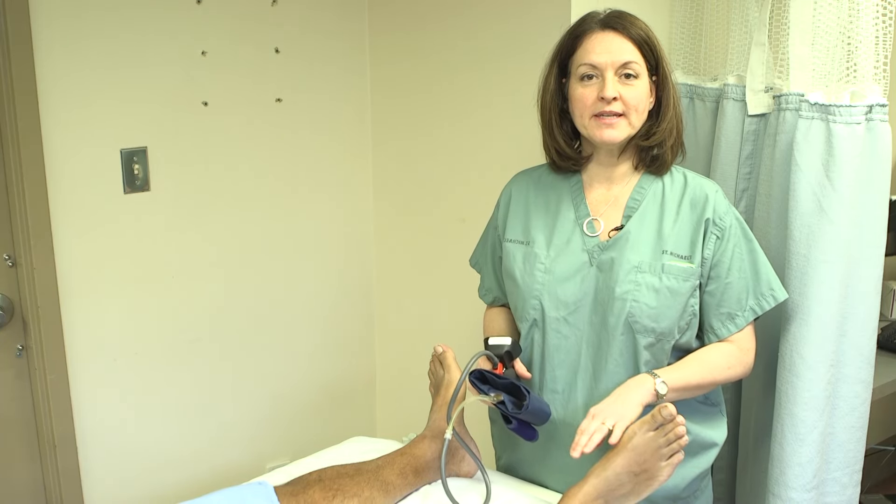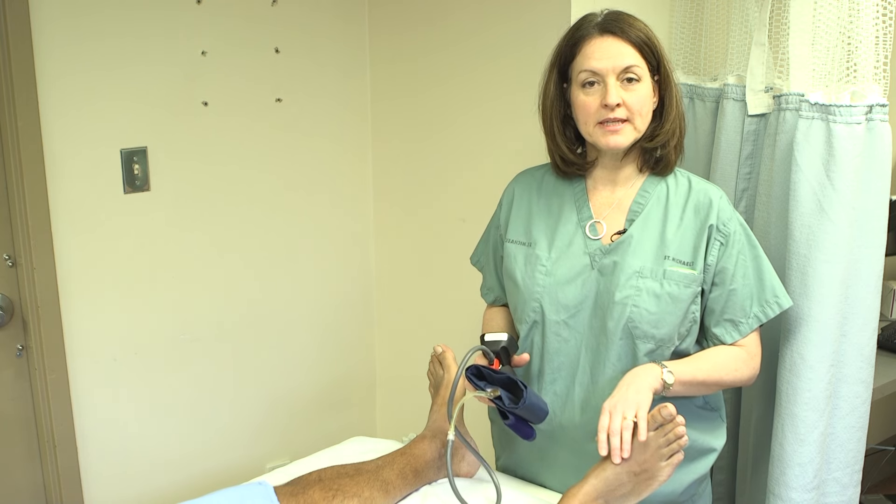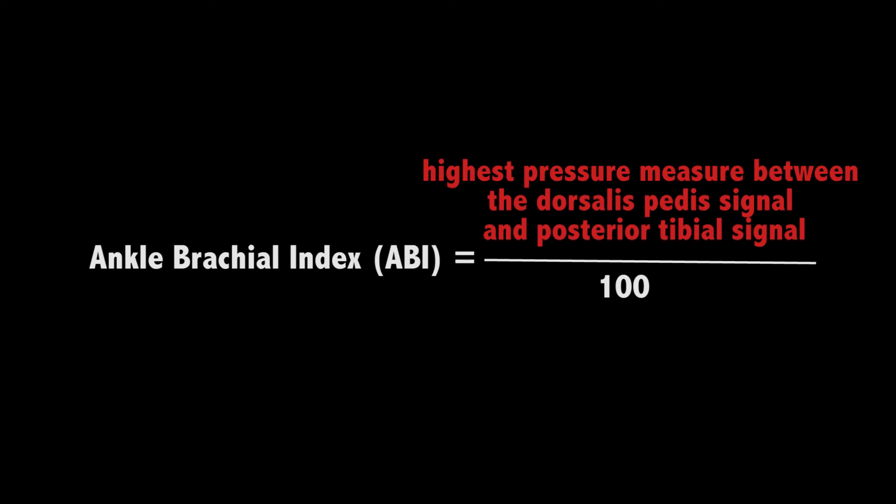Now we're going to repeat this on the other ankle. We're going to again measure the dorsalis pedis and the posterior tibial. We're going to take the highest measure and use that as our numerator for our calculation of the ankle brachial index.